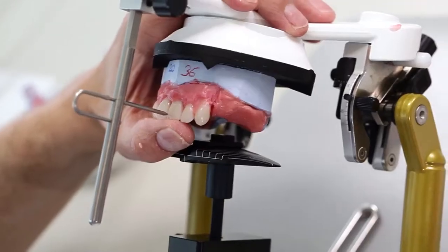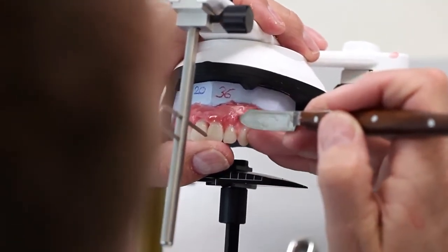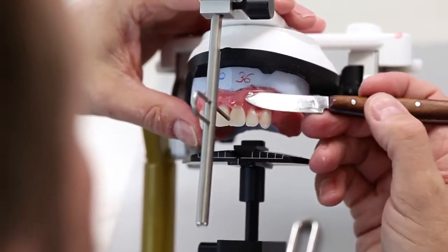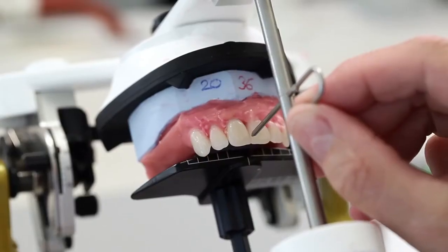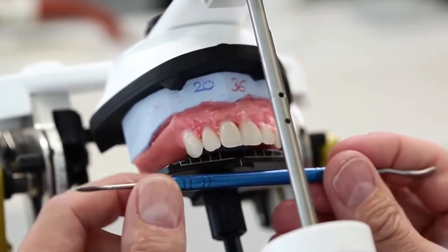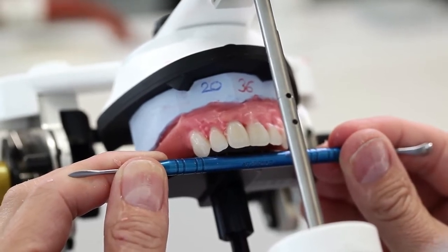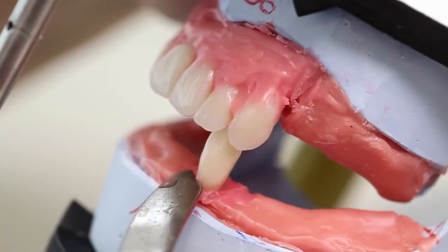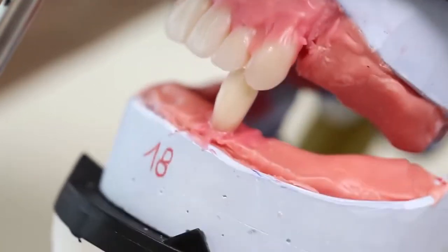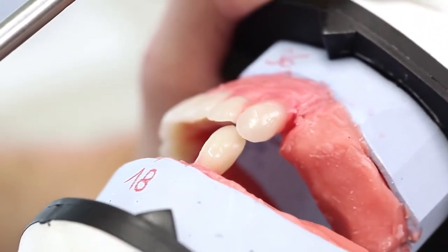After the setup of the maxillary anterior teeth, they can be checked using the setting up template. The symmetrical line system of the template enables the verification of the harmonious position of the teeth. This lively setup supports the natural effect of the dental reconstruction. The extension of the longitudinal axis of the mandibular canine points between the maxillary lateral incisor and the canine.